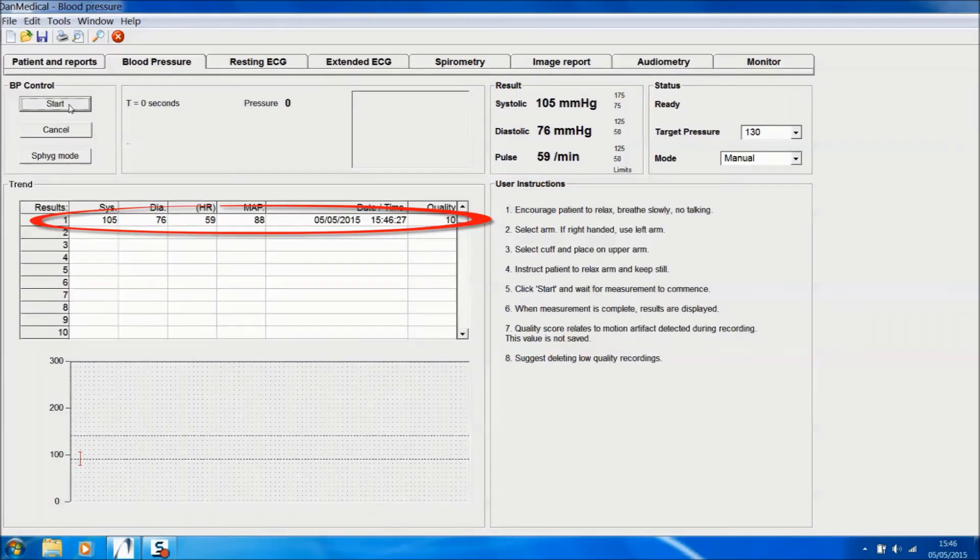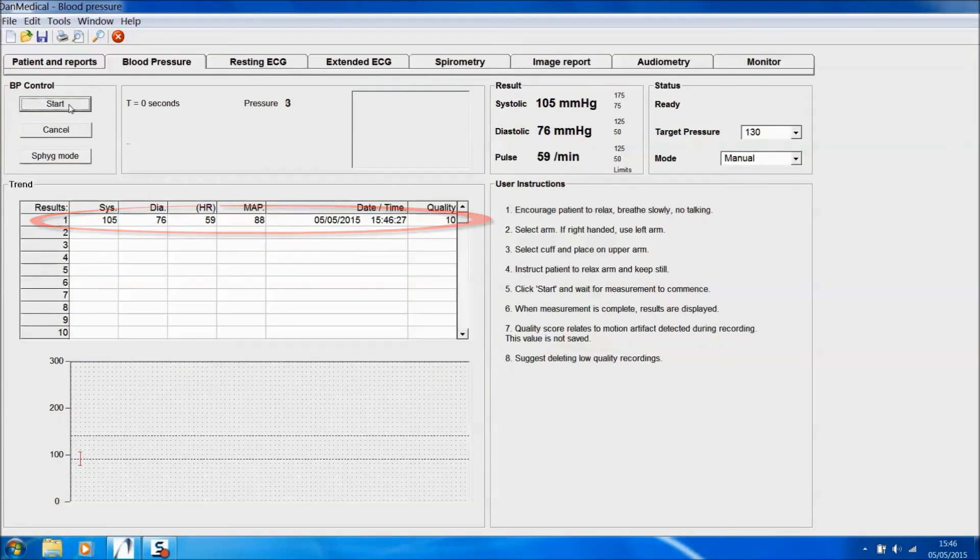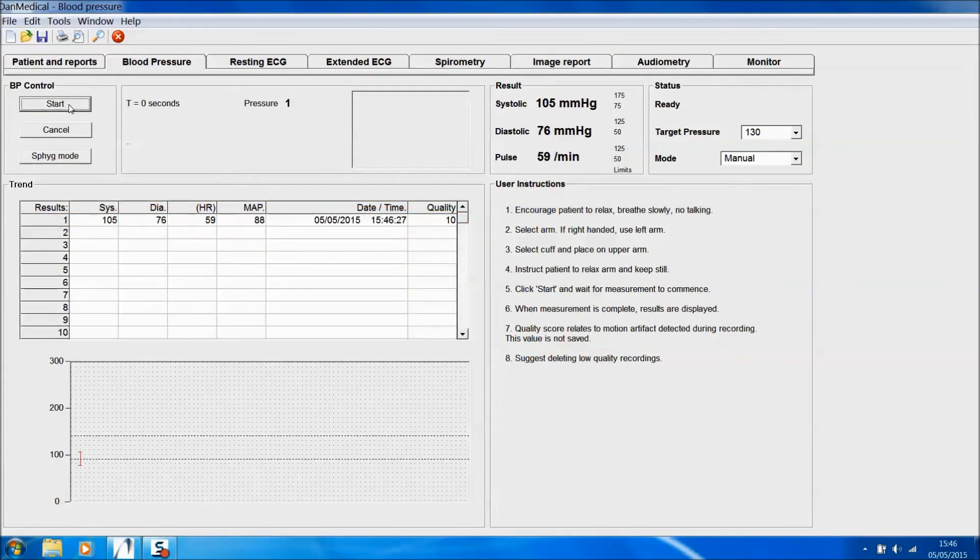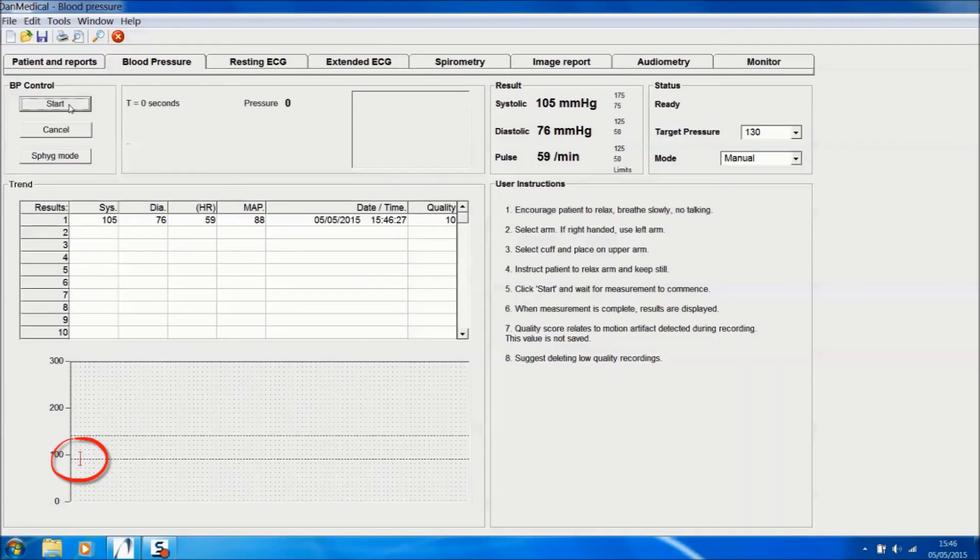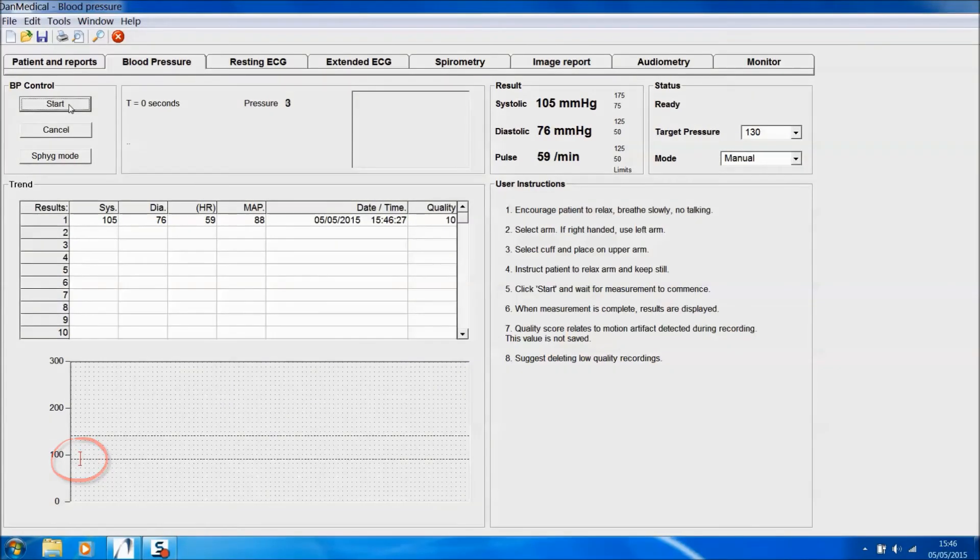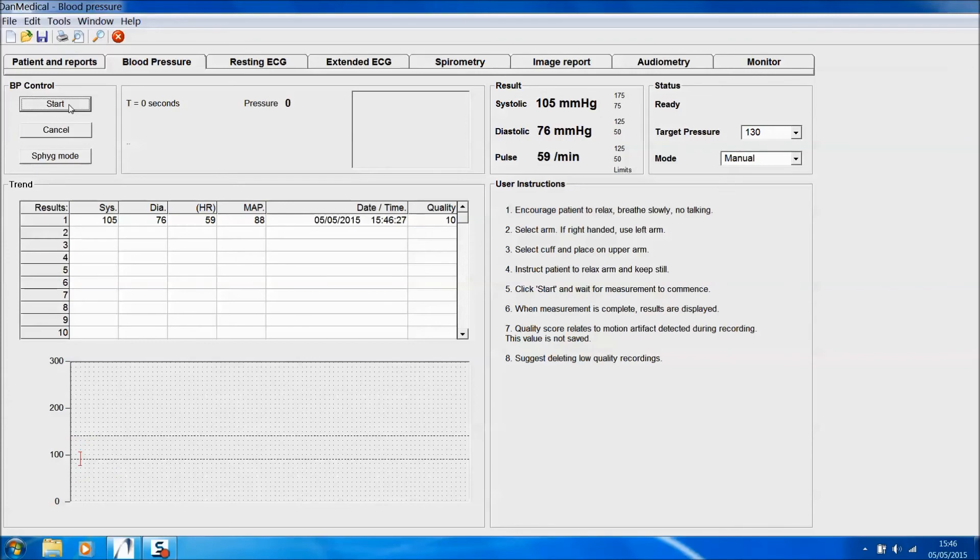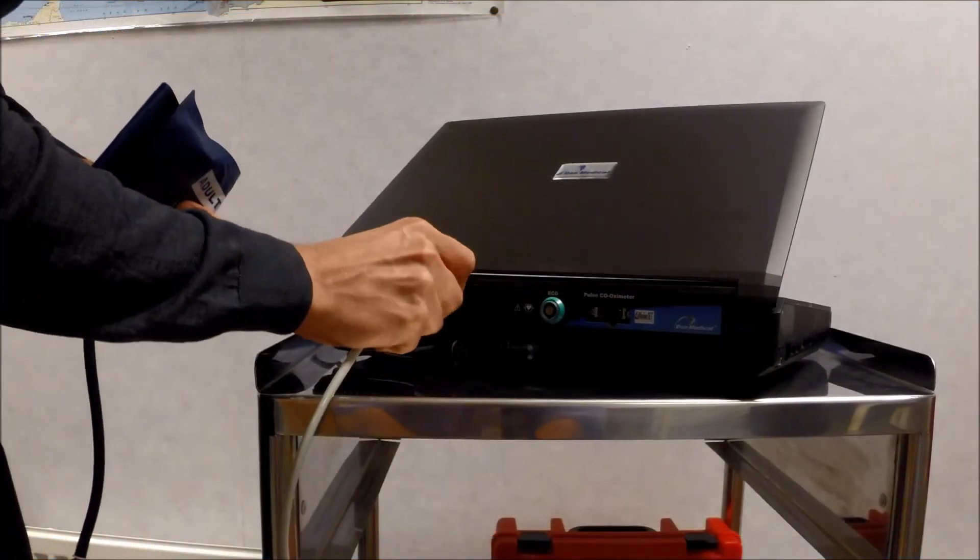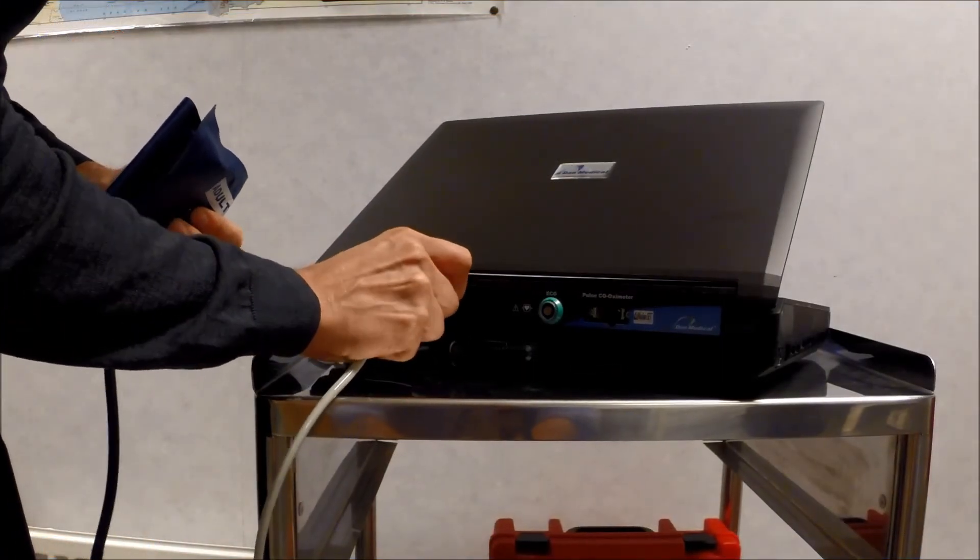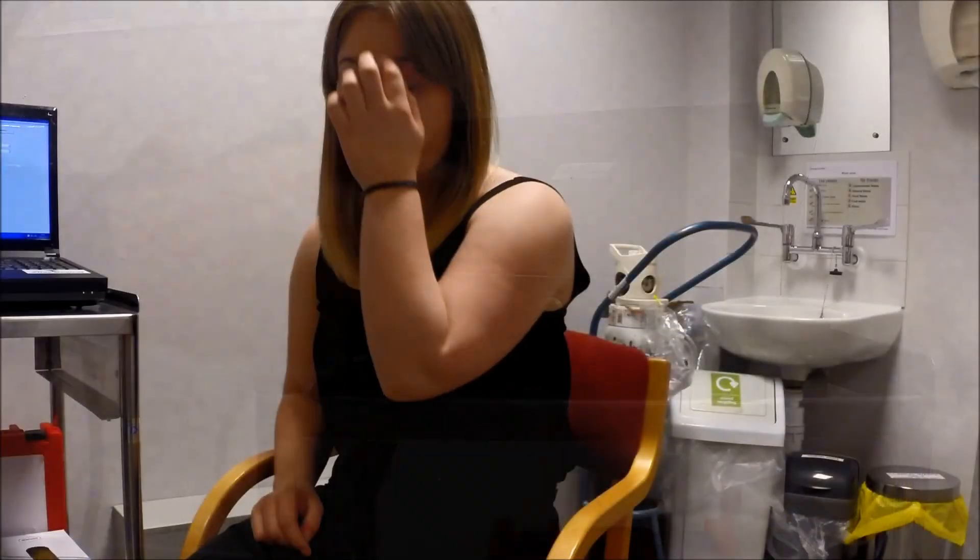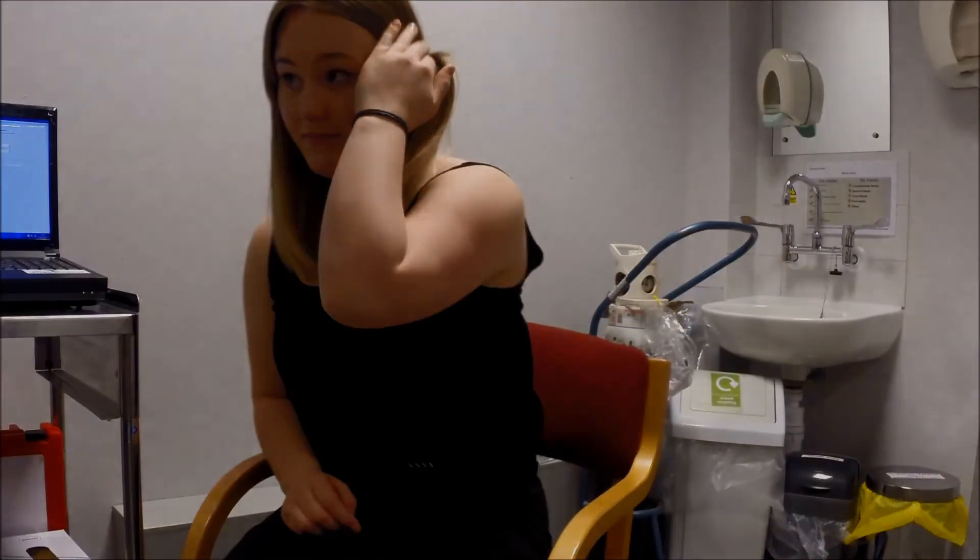The full results are entered into the data table. In addition, there's a graphical representation at the foot of the page, useful if you're taking a series of blood pressures over time for trend analysis. Remove the hose by pulling on the circular collar.